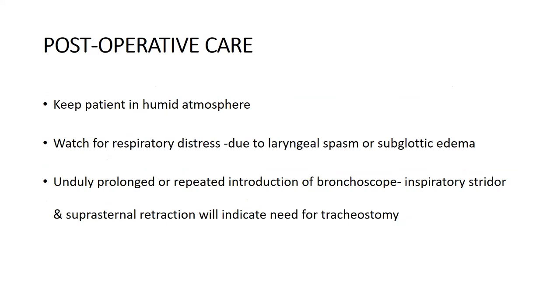After the procedure, the patient should be kept in a humid atmosphere and observed for any respiratory distress due to laryngeal spasm or subglottic edema. Unduly prolonged or repeated introduction of the rigid bronchoscope may lead to inspiratory stridor or suprasternal retraction, which is a need for tracheostomy.